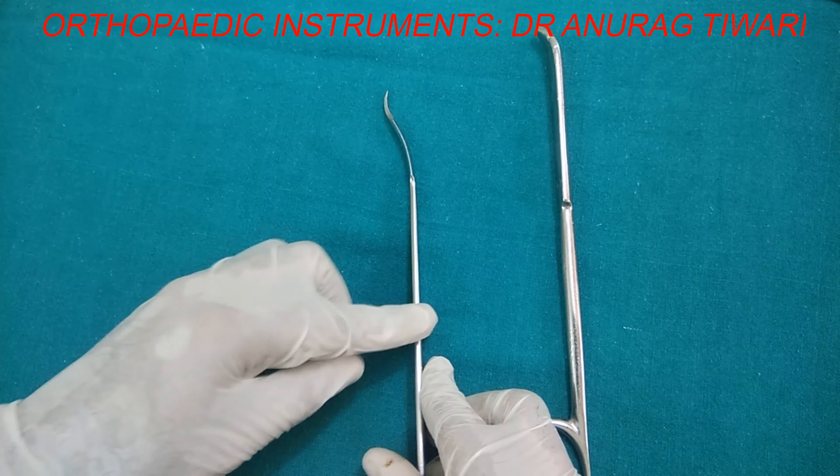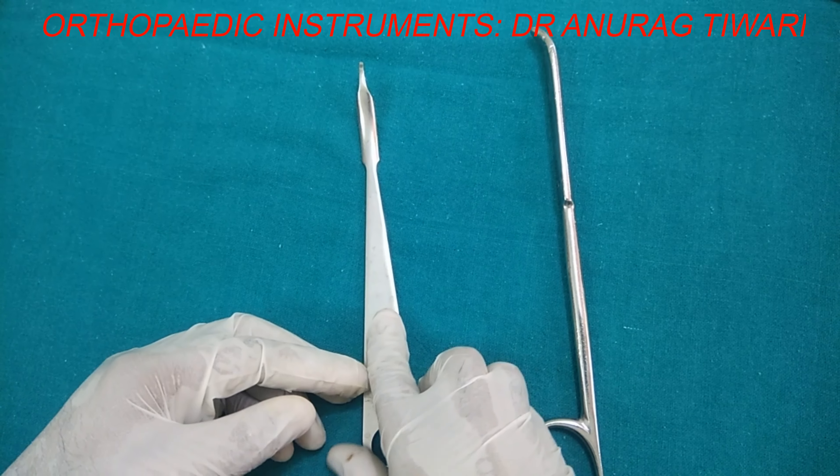Next are scissors. There are two types. The dissecting scissor has narrower jaws and is sharper — it is the tissue dissecting scissor, held with thumb and ring finger and used to dissect tissues. The other is the gauze-cutting or suture-cutting scissor, also known as the Mayo scissor. It has a thicker, broader jaw and the front end is not pointed. Scissors can be straight or curved.